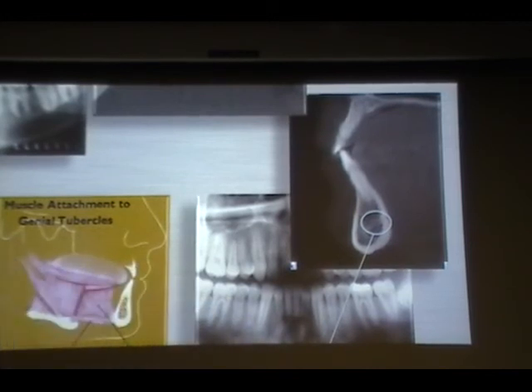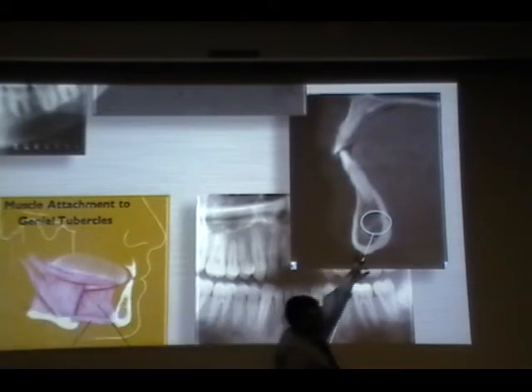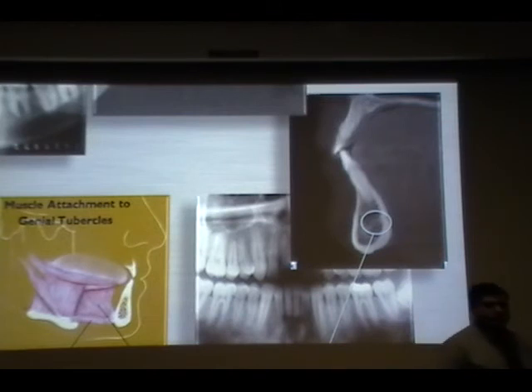People say that anteriorly, not much we have to take care of. That's true, but exceptions like this will be there. If you place an implant that is longer, and it hurts this lingual foramen, because there is a lingual nerve there, then the patient will complain of paresthesia.